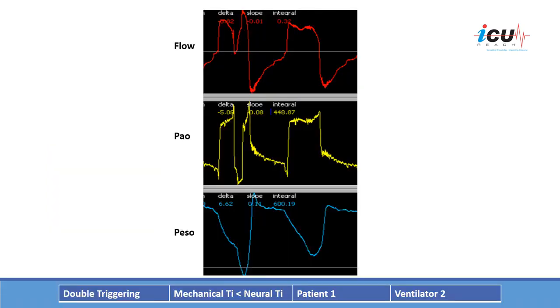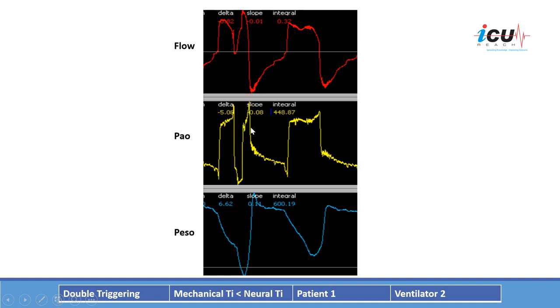The last case is double triggering. The esophageal pressure here is negative and prolonged — the neural inspiratory time is longer than the mechanical inspiratory time. The inspiratory time set on the ventilator ends at this point, so the ventilator cycled off into expiration. However, the patient was still in inspiration, and this continued drop in pressure triggered the ventilator again, delivering another breath. You can see this clearly on the flow: the first breath tries to cycle off, but the ventilator is triggered again without an expiratory phase.